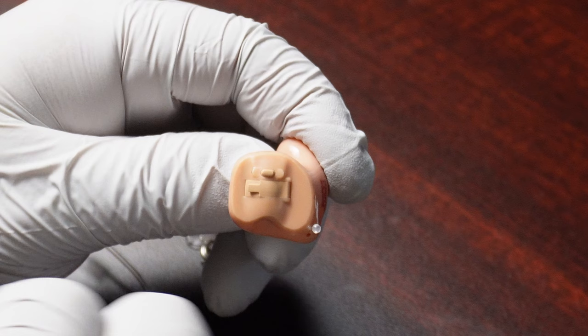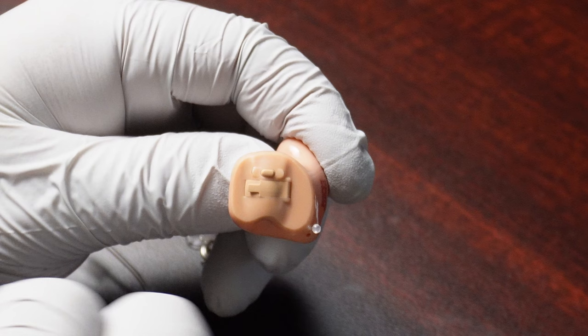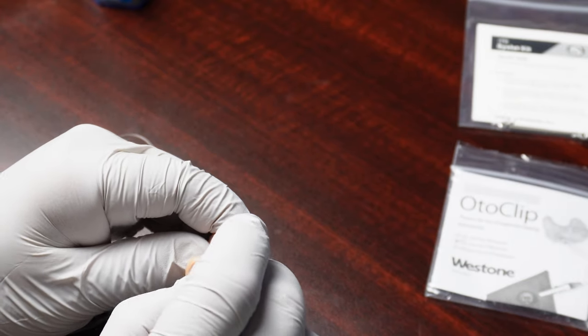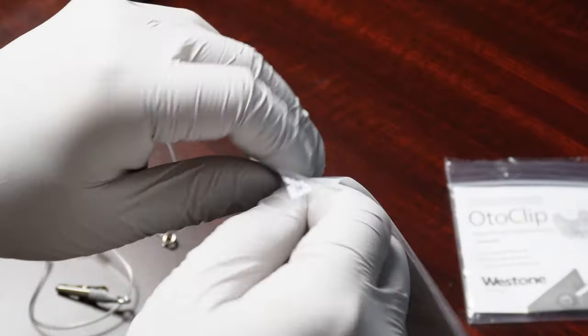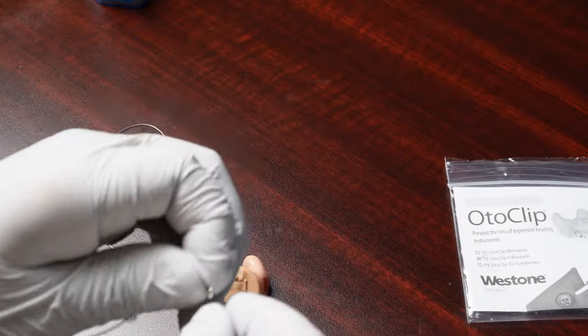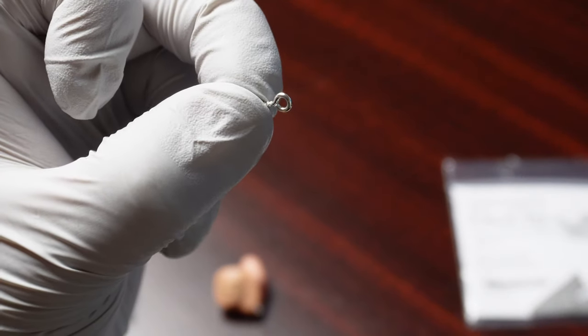You want to put the hole in the tragus notch, or what's called the heel. This is the bottom corner of the hearing aid, usually where the vent is. And a couple things you want to make sure of is, one, do you have enough room for a hole? And you also have to make sure that once the eyelet is screwed into place, you're going to have room to open the battery door. So make sure you have room to open the battery door. Make sure the hole and the eyelet is not going to interfere with that. And once the battery door is open, make sure you're going to be able to put the battery in there.